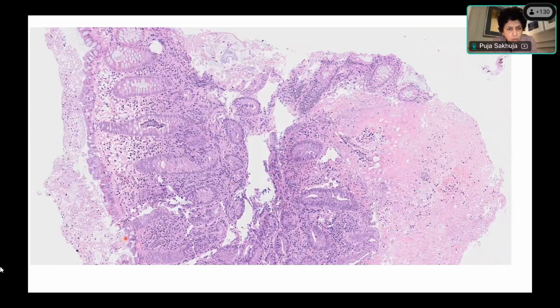Did you manage to see it as a video? Anyway, some of you did and some of you didn't, but the video did not, I think, show anything very much, just went around the same area that you're seeing here. It's not letting me move it as a video here either.